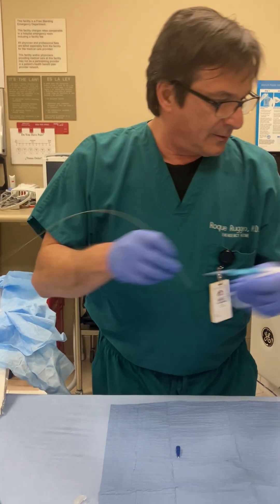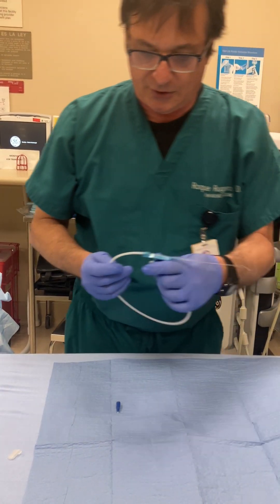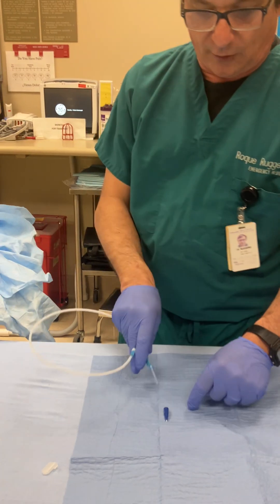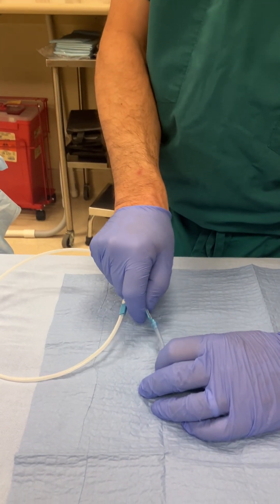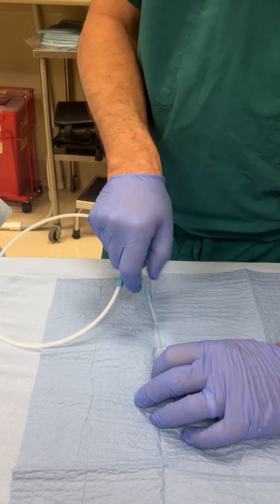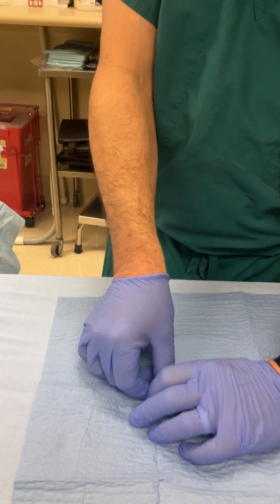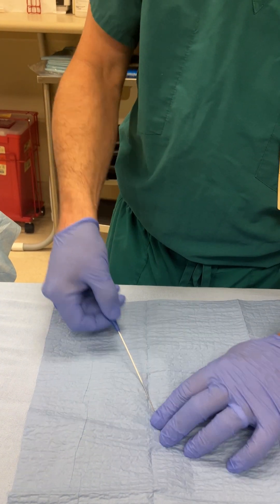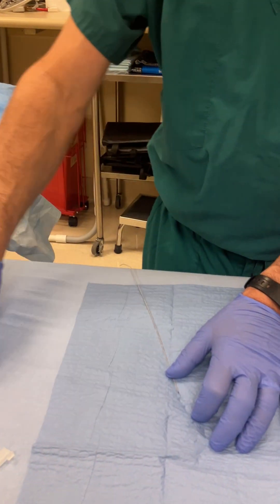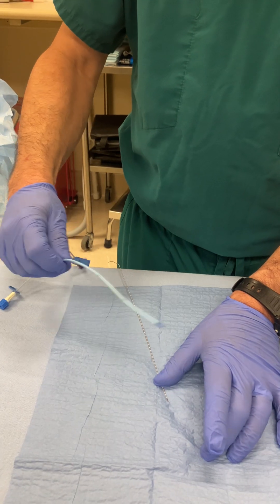Let me get another wire and show you with the catheter. You have to remove the needle from the catheter — this wire will not advance through the needle. So now I place this here, I advance the wire through the catheter. Now that I've advanced it through, I can remove the catheter because the wire is staying in place. Then I do all the same steps: I nick the skin, I dilate, and then I advance the catheter and secure it with the anchors.